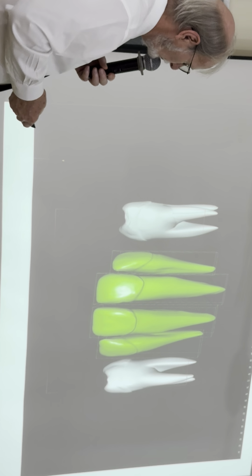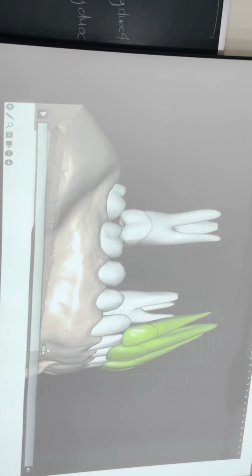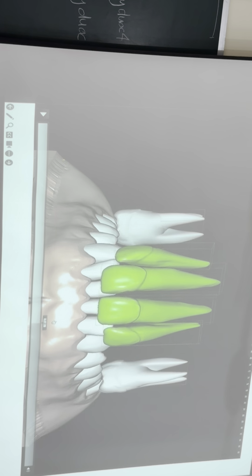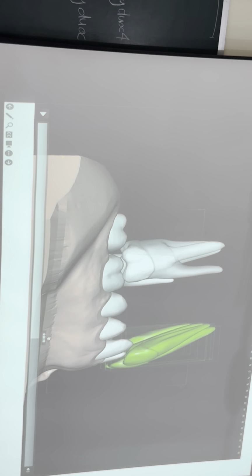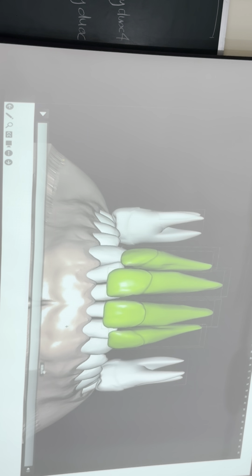From here, remember you treat patients in 3D, right? And look, that's why you have problems with midline, by the way, I'm sure you do because everybody does. This is what's important. So this is cool. Overjet correction, easy. You know, the movement, this other movement, easy. It looks like it's easy, right? Everything's easy. It's no problem. Okay? Then you go here. Look at the apex. Not so easy anymore. Look at the apex, what they have to do.